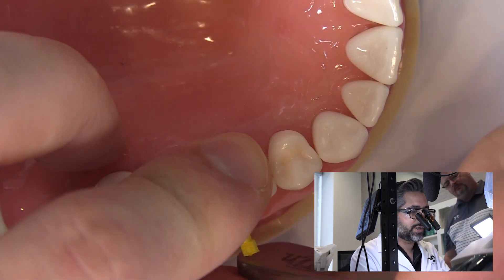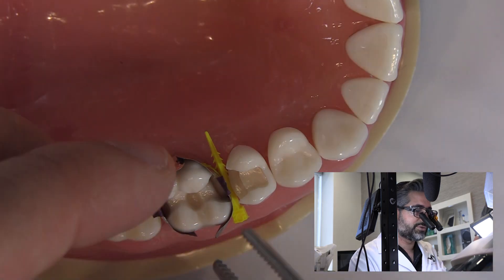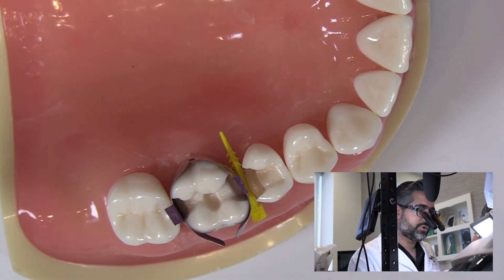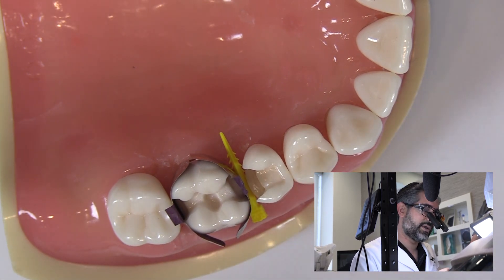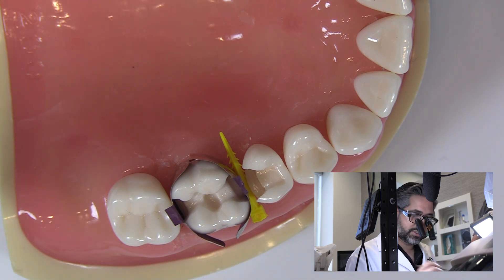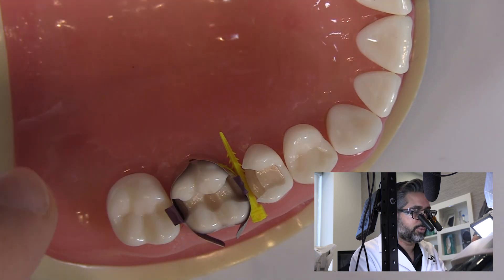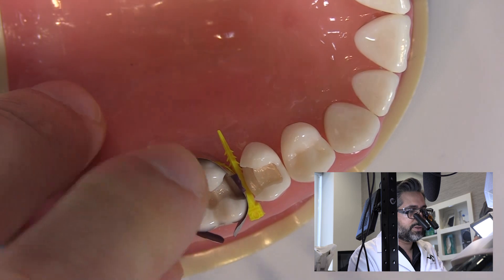The purpose of this wedge at this point is strictly to keep my matrix in place. When I apply my dentin bond, the purpose of this wedge right now is mainly to keep the dam sealed, prevent moisture from coming in, and prevent my dentin bonding agent from escaping and puddling beneath the margin — creating a ledge or excess. I don't find you need to wedge very significantly with this system, because the matrix band thickness and the ring's wedging effect gives me a desirable contact without heavy wedging. My goal with the wedge is only to improve the gingival seal.